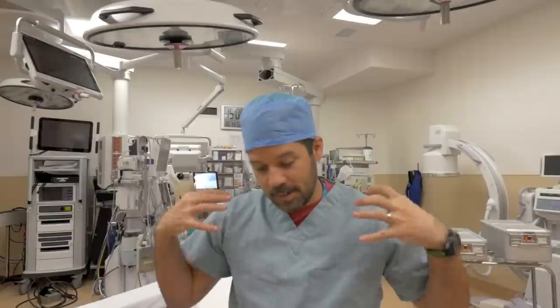First things first, what type of cases are you going to be using a Bookwalter or any type of table-mounted abdominal retractor? Pretty simple answer: it's going to be any big open belly case — small bowel, large bowel, anything pelvic, anything in the retroperitoneum, kidneys, abdominal aortic aneurysm, stuff like that. Deep abdominal retraction — that's what we're aiming for with this system.